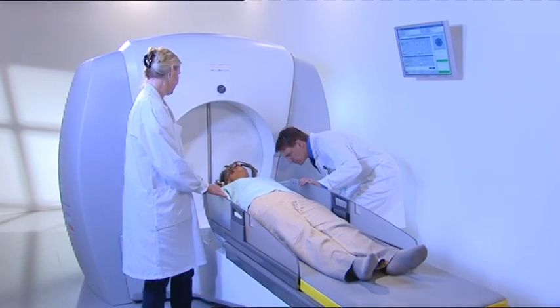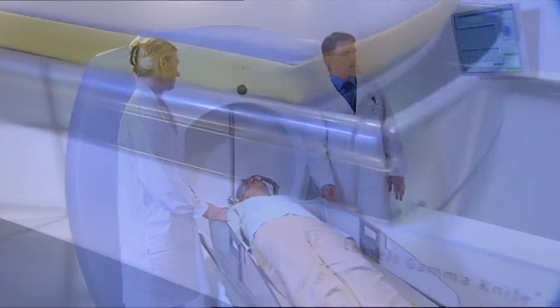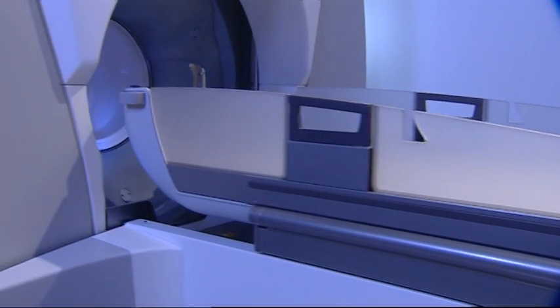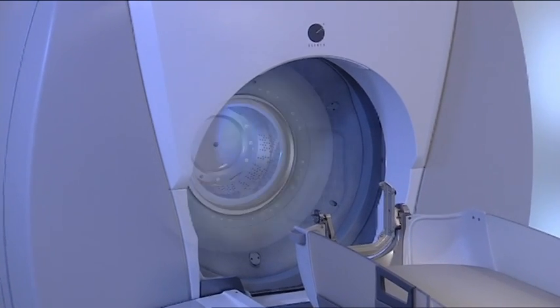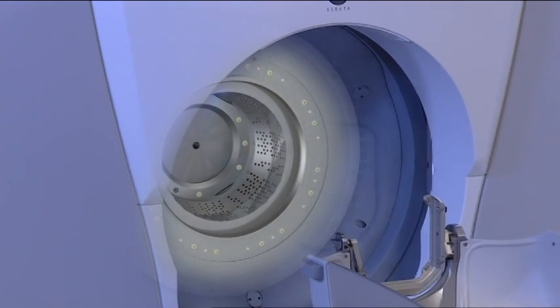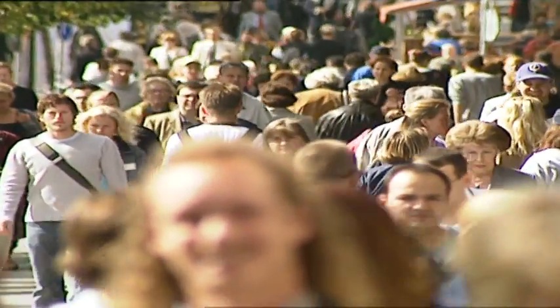Gamma knife surgery is a well-established treatment method used to treat selected neurological diseases. Lexel gamma knife is not a knife in the normal sense of the word. The doctor makes no incisions. Instead, precisely focused beams of radiation are directed to the treatment area. The treatment is painless and allows the patient to quickly return to normal routines.